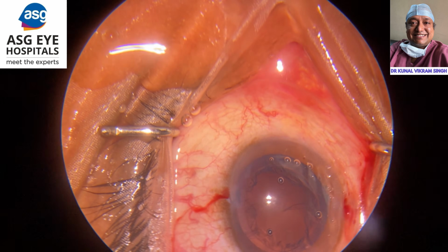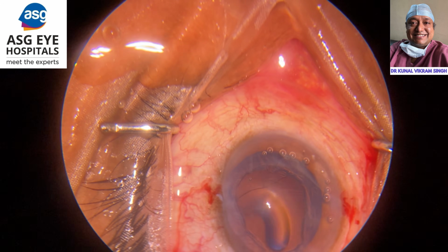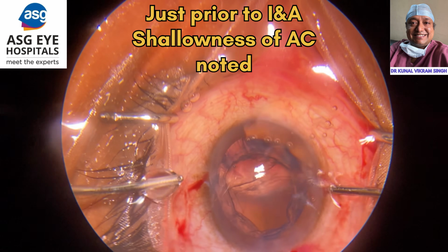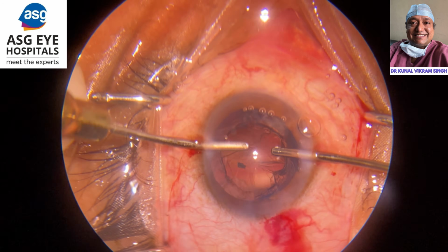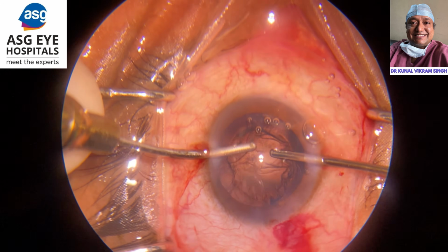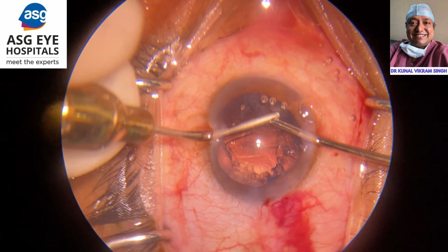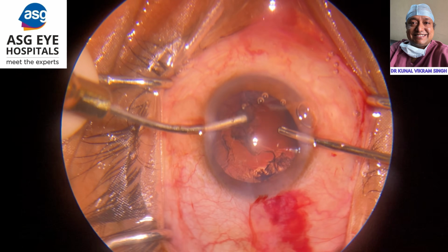By this time, I had already completed the nucleus disassembly, which was pretty routine. I did not have any hint of zonular laxity, so I filled up my AC with visco and started irrigation and aspiration for cortex removal. When I started, there was a hint of shallowness of the AC, which was not out of the ordinary.